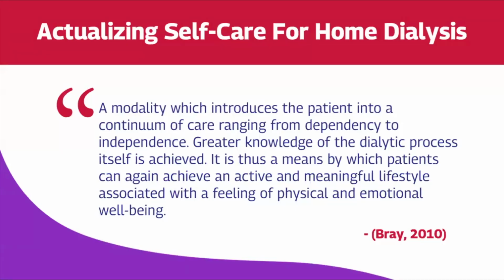Self-care in-center hemodialysis is a modality of hemodialysis where the patient performs part or all of the treatment process in an in-center setting. The nurses and staff act as the educators and support system, guiding the patient from a state of total dependence to a state of independence. And if the home situation is suitable, the patient may even transition to home hemodialysis.